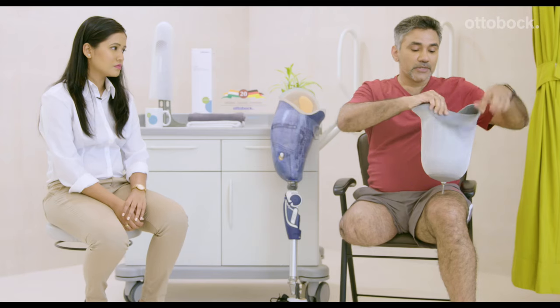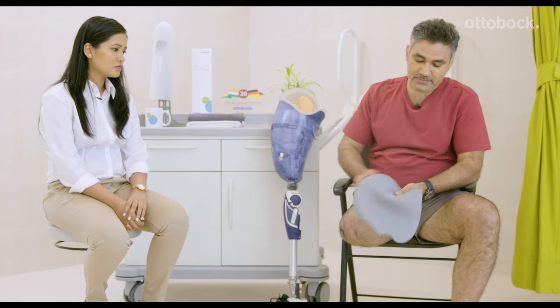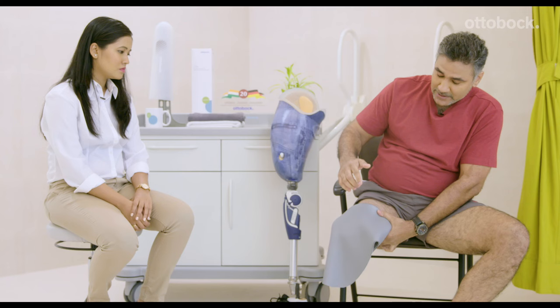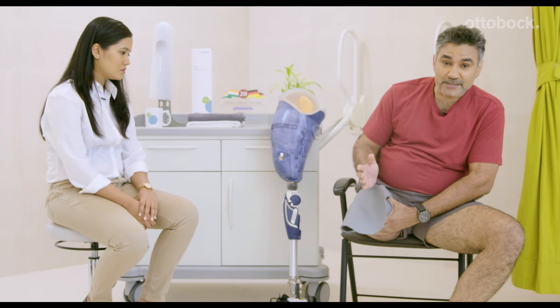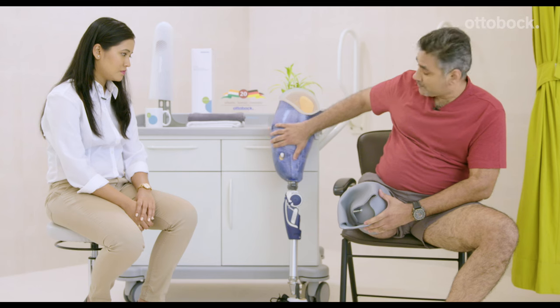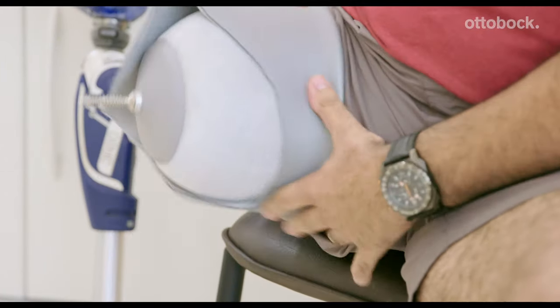Take your liner and roll it inside out all the way till the end. Touch the base of the liner to the base of your residual limb. Make sure that there is no air trapped between the liner and your skin. The pin of the liner should be in the longitudinal axis of your residual limb — the pin should not be at an angle or curved. You need to check this because the pin fits into the locking mechanism of your socket. Now pull the liner all the way up till the right side is out.